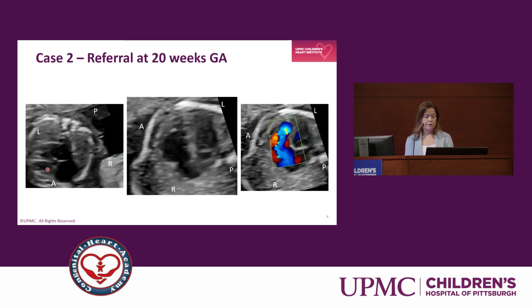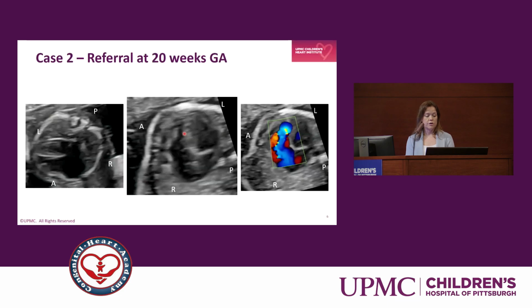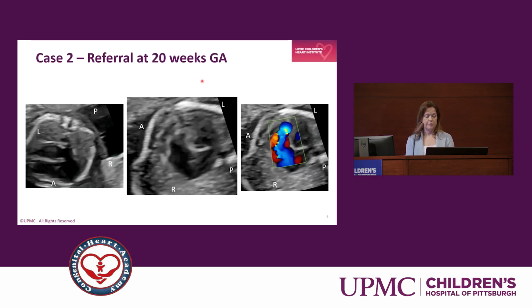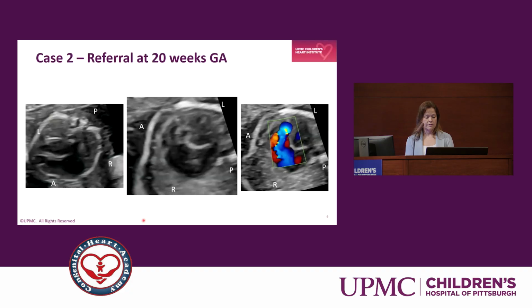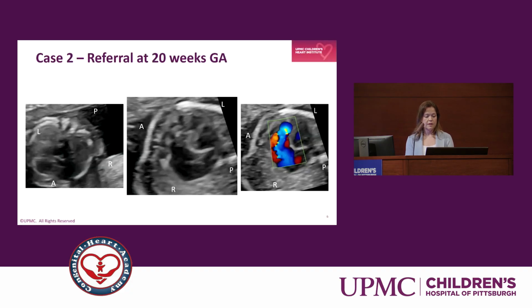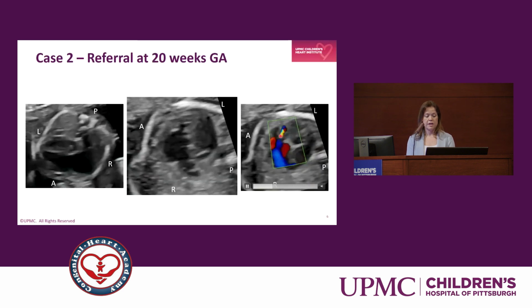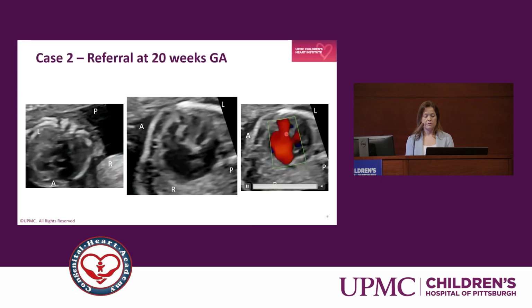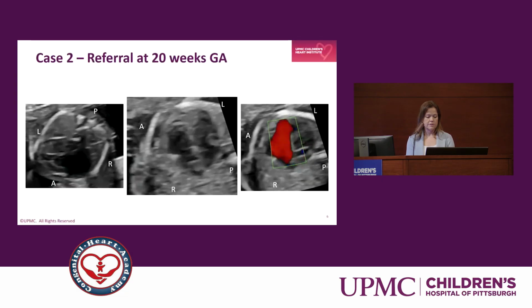Although in the first clip, the tricuspid valve anatomy is not all that well seen, here we could start to appreciate that the septal leaflet was not obvious and likely displaced, and the anterior leaflet also had abnormal attachments. And with color, we can see that the tricuspid insufficiency jet starts nearly down at the right ventricular apex with a wide, broad jet of severe insufficiency.